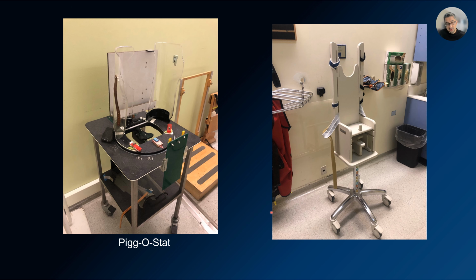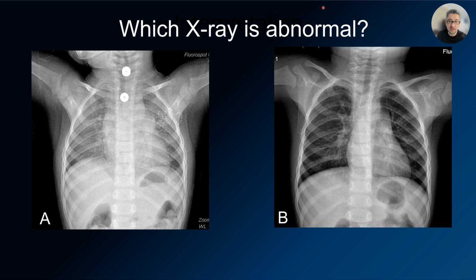In pediatric radiology practice, stabilization of the patients is very important, as infants and younger children are usually not cooperative. Pigostat was introduced in the 1960s, and similar equipment can be used to stabilize children during the X-ray studies, as you can see here.